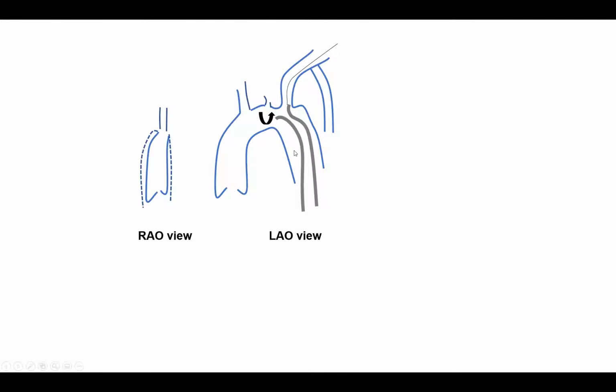In this particular case, counterclock rotation will point the catheter a little bit more posteriorly, whereas clock will point it a little more anteriorly, which wouldn't work for the supraaortic vessels. I will illustrate that concept in another slide later, how 180 counterclock is not the same as 180 clock. If it was the same, our life would have been very easy because you could do whatever you want with the catheter and it will reach the same point. But our life is not as easy. That's why you need to know those ideas. So counterclock always to get the left subclavian.